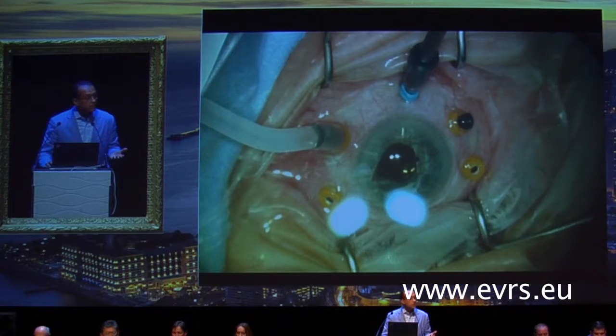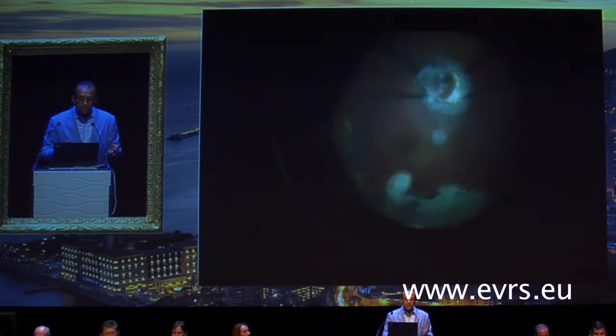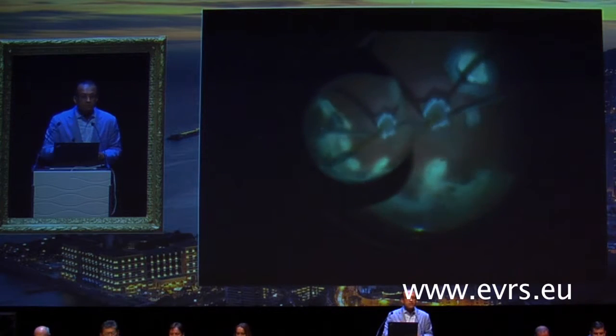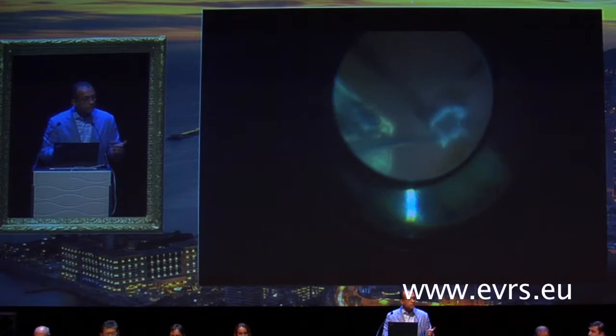So what I did instead, I got choroid and retina. I went to a peripheral area, the only area that is left. He had a lot of scarring, as you see, inside the eye, and I was very successful getting choroid and retina. But the mistake that I made is that I dissected prematurely the retina off the choroid, and it's very difficult to maintain 2 layers inside the eye at the same time over the fovea.